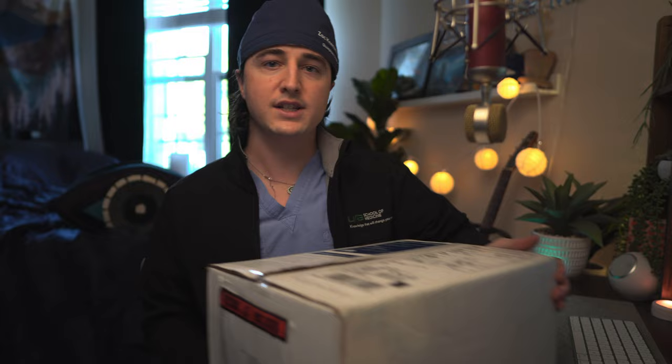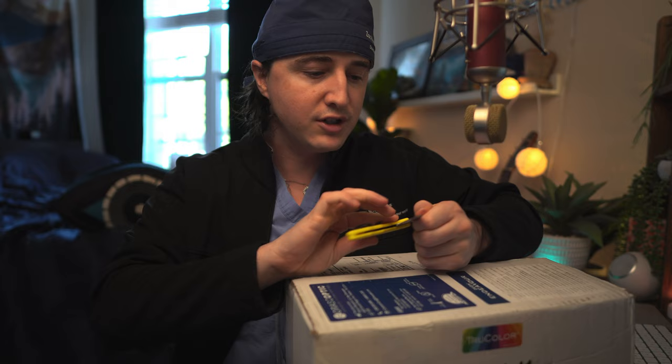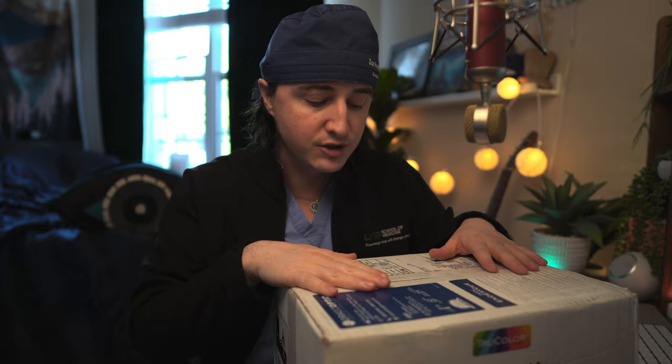This box has my new loops in it. Oroscoptic is a company that maybe not a lot of physicians know about — more people on the dental side know them. I came across them on Instagram, and also in my journey to find new loops when I started my oculoplastic surgery residency. I had some Designs for Vision loops, wanted a new pair, so I reached out to them again and tried their higher-end loops. Then I met with Surgitel — I liked their loops better than Designs for Vision overall, but I didn't like their frames as much.